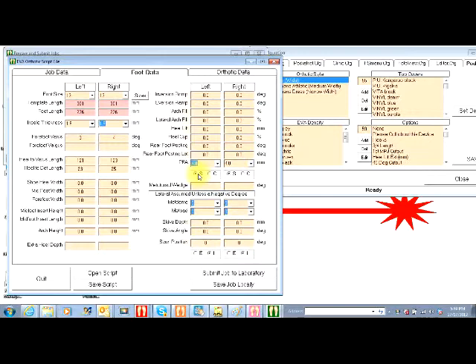If they want us to use external met domes and met pads, we find that they're a little bit more effective than building it into the device, because most of the EVAs we use are a little bit hard and they prefer a softer met dome or met pad. They just click there and then tell us what sizes we want. I have two different companies that I buy them from. They're the straight teardrop ones, the small, medium and large, and the left and right dependent ones that you can get. Met pads is just a small, medium and large.